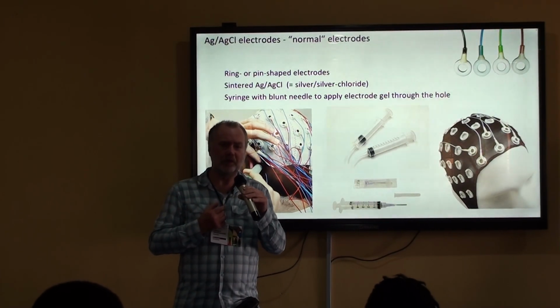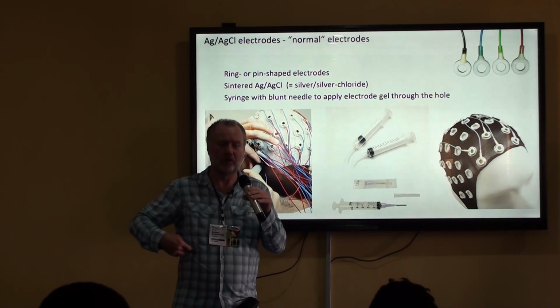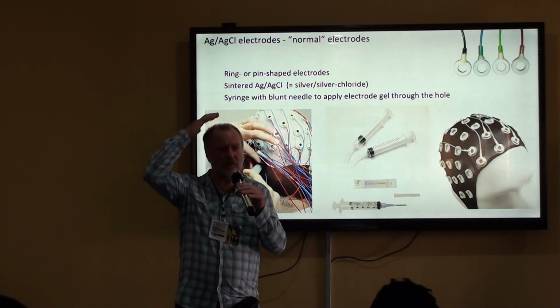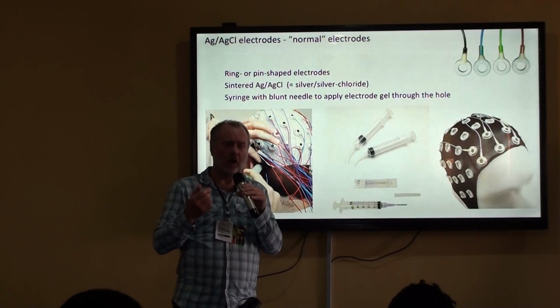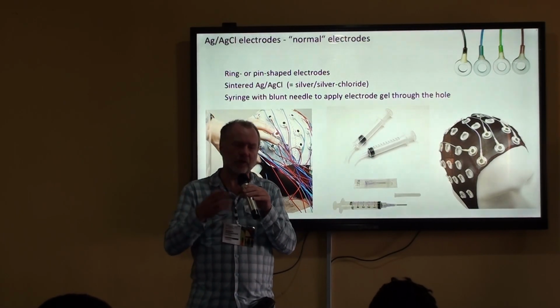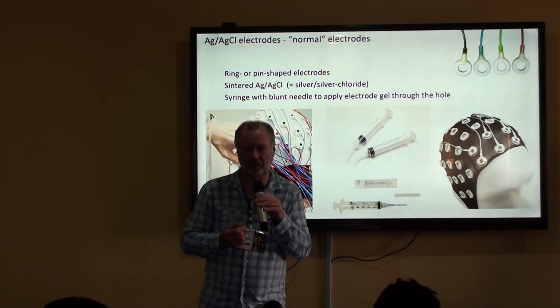So for me, I would typically place one electrode here, and then I can record the heart activity just well. And then I would use that to help clean the EEG data, or to see whether there's a relation between the task and the heart rate of the participant. For example, if a task is very difficult, the heart rate might go up, and that would be a potential confound that you would want to know about.